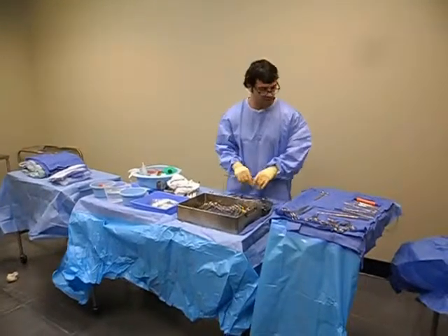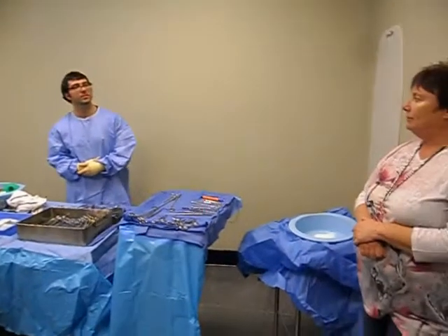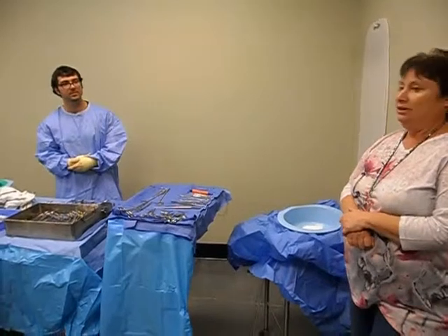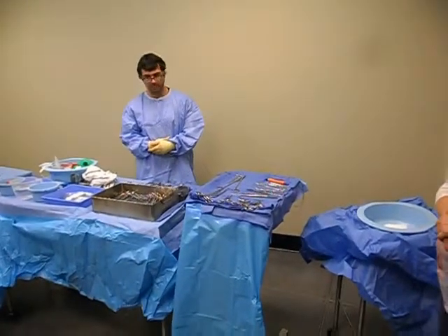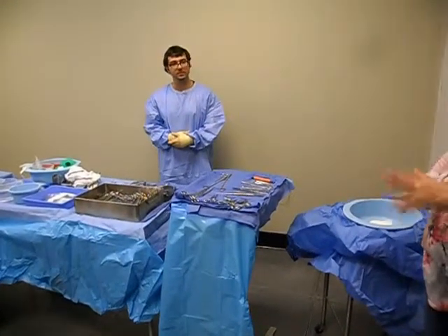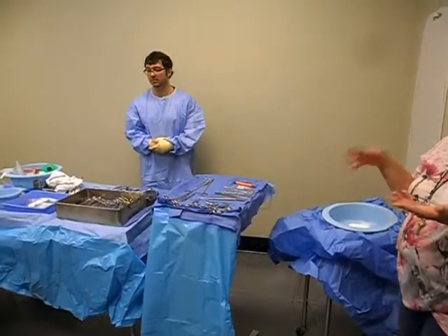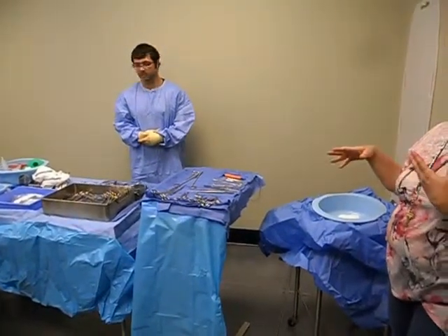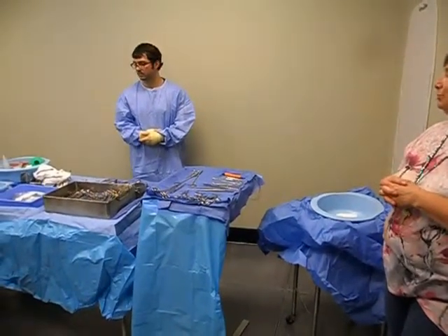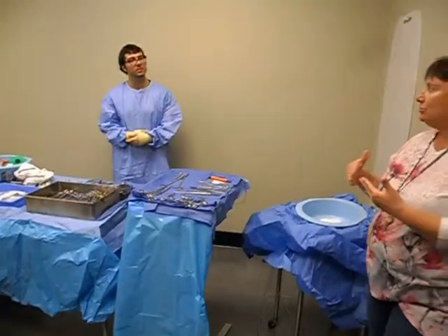This I would put. Okay, so you're over your time, because I threw you for a loop a little bit and gave you a lot of stuff. And that is what the real world will be like. You will get a lot of things. You're all used to practicing with the same custom pack and you switch a few things, but not a lot. We did a lot of things different here. I opened things on different tables, I totally changed things, and that probably threw it off a little bit. What you had planned, I just threw a monkey wrench in.